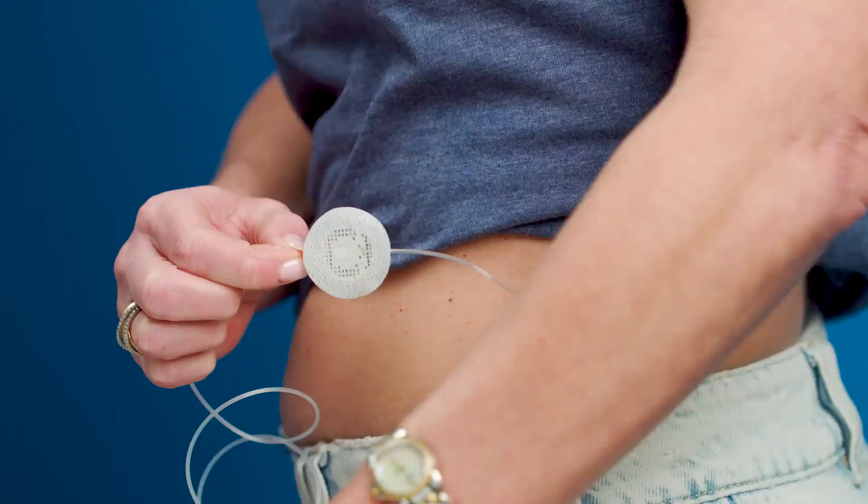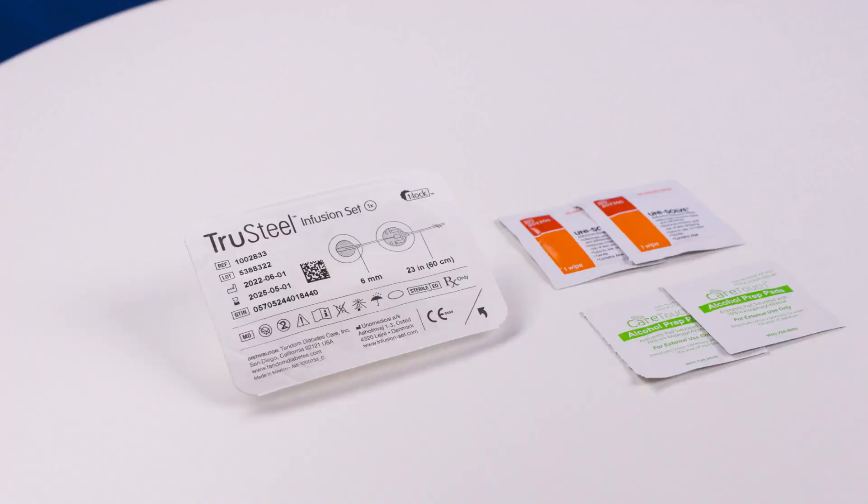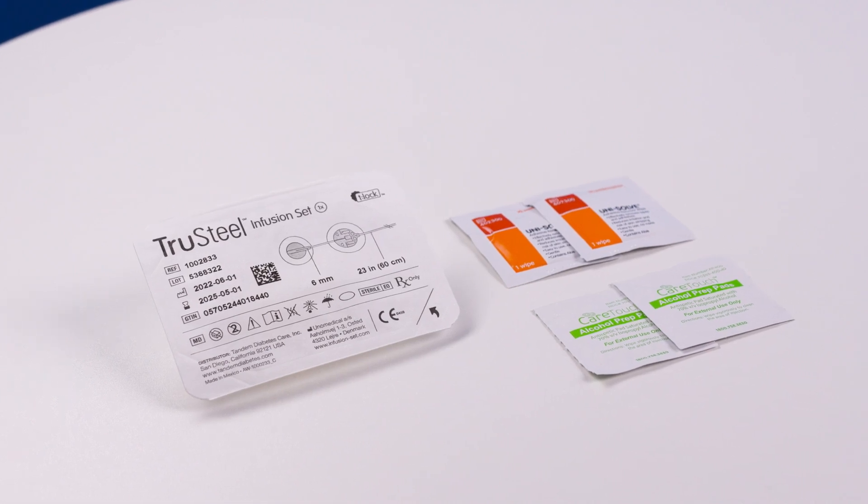You'll also notice that TruSteel has a second anchor patch, giving you extra security and stability. Before you get started, make sure you have all your supplies ready. You'll need your insulin pump with a filled cartridge already installed, a TruSteel infusion set, and any additional supplies.